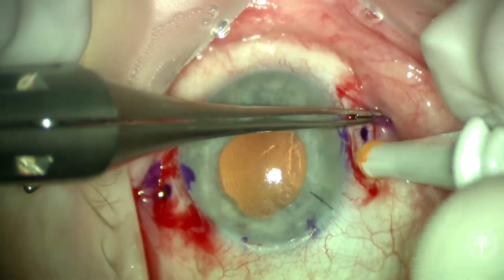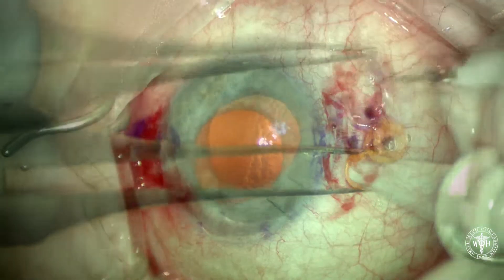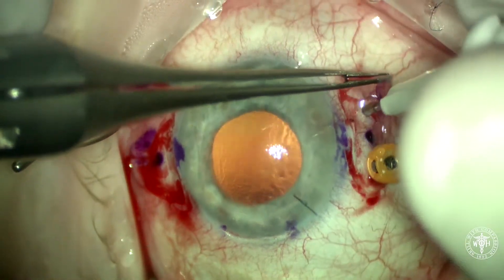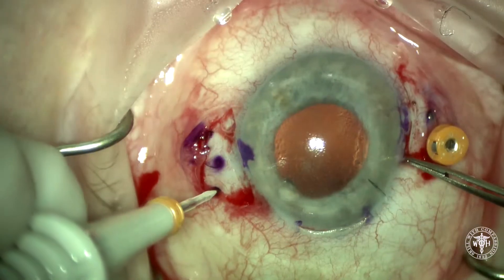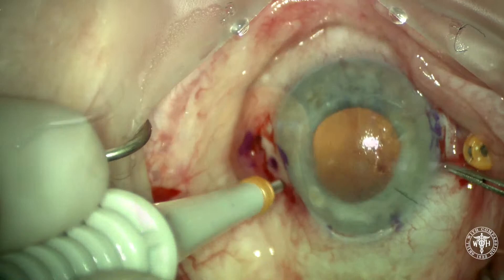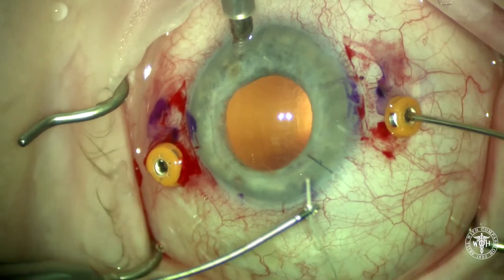This is a 23-gauge valve trocar. I like to use these trocars to help retrieve the Gore-Tex suture from inside the eye. The more proximal sclerotomy to the surgeon is going to be a trocar; the more distal is going to be just a sclerotomy stab with the blade.